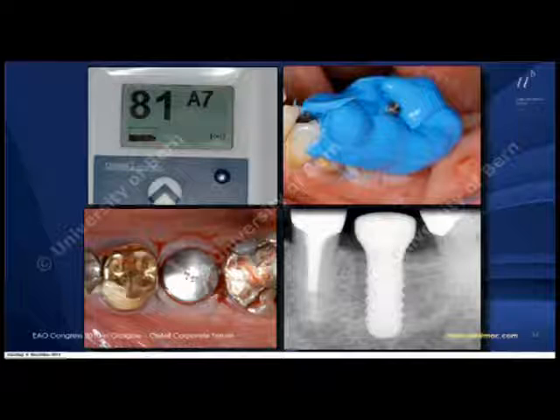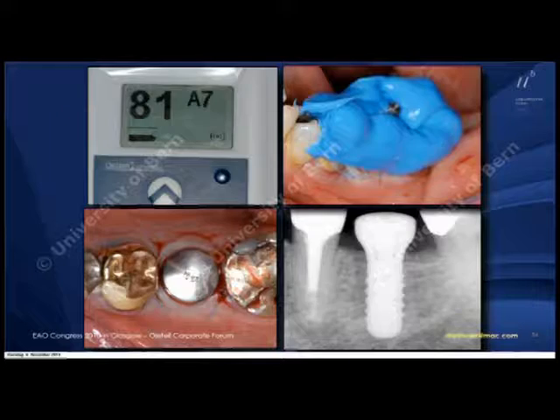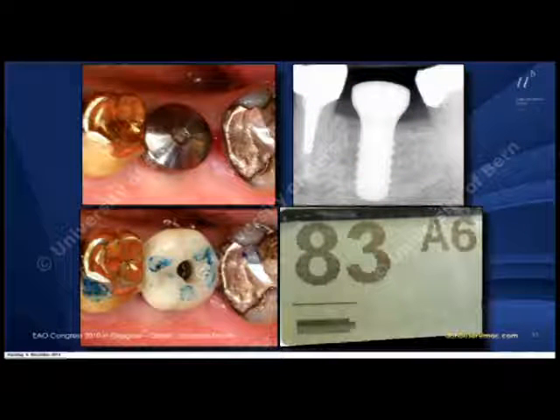Here you see in this patient it was an 81, a very high value, and you see now then the healing cap. Same patient 3 weeks later, when you have such a high value, then you want to see a slightly better value, but not a clear decrease, otherwise that would make me nervous. You see 3 weeks later, the measurement 83, so this prepared provisional crown got in place, and you see adjusted the occlusion, and then this implant was in full function. The implants were at least 10 millimeters long, also not extra short implants, 10 or 12 millimeters.